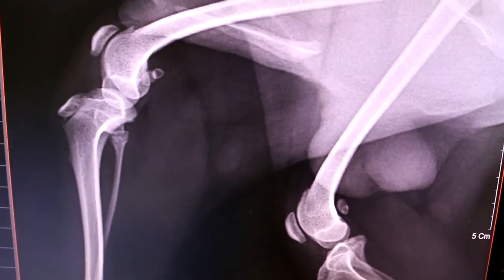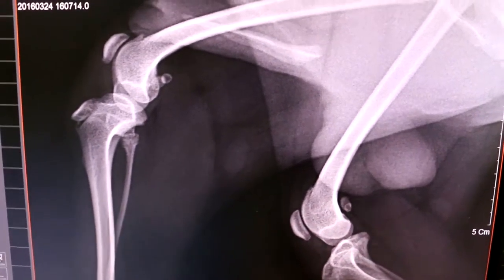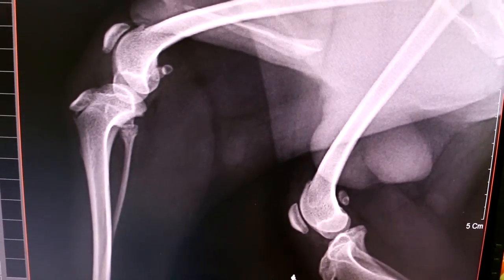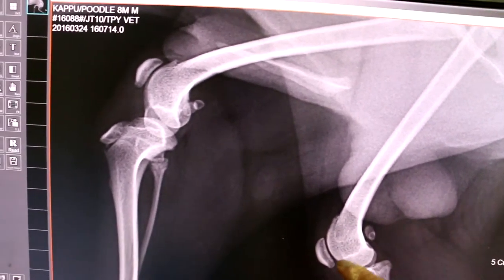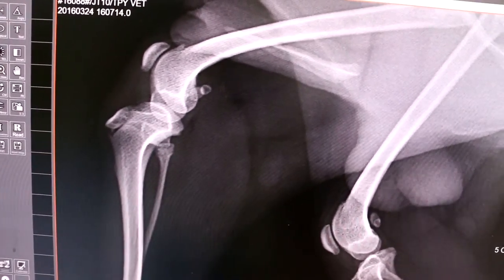No fracture of the growth plate. The growth plate is very close right now. I put it back already — the patella came out nicely. This was before the x-ray.